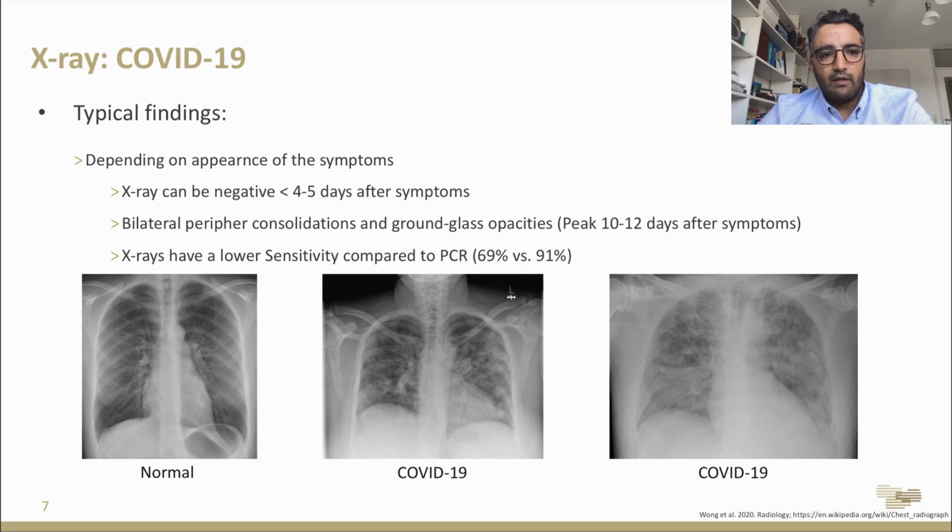Now we talk about X-ray. X-ray is our workhorse in the hospital. What are the typical findings of X-ray? I think it's very important for IT and informatics specialists to understand how it actually looks. We're going to talk about X-ray here. What are the typical findings of X-ray?